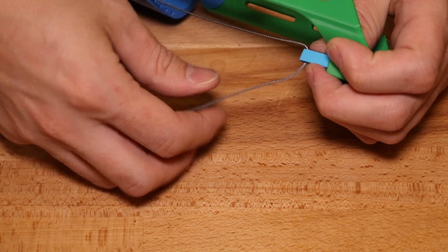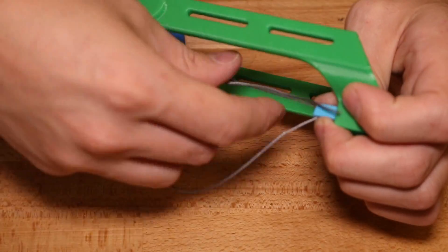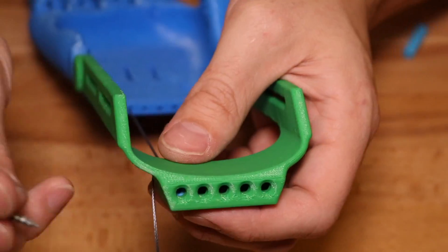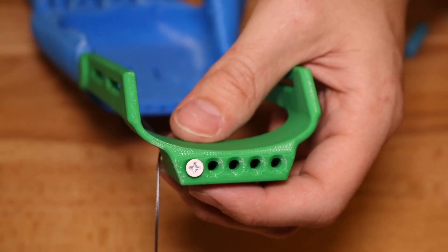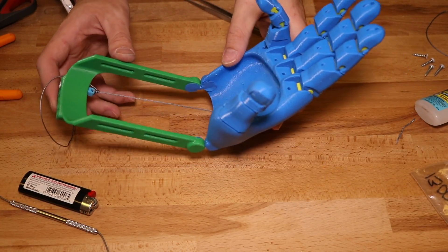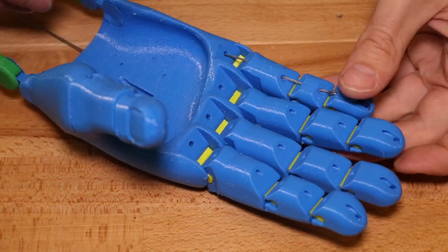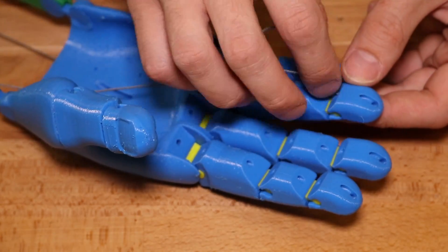Once the fishing line has been threaded all the way through the palm, tie it back onto the tensioner block at the end of the gauntlet. Tie a knot at the end of the tensioner block and then use a screw to thread into the tensioner and tighten it to adjust until the finger articulates freely. Now repeat this process for the four remaining fingers.